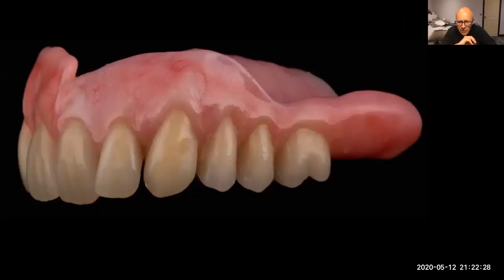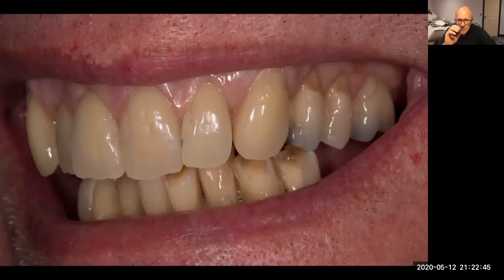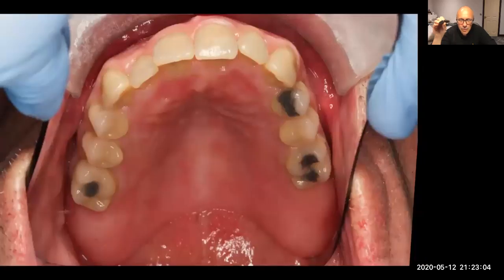But I want to share with you how to do that tooth characterization even more. So this is a case here. This is Ron's denture before it's been characterized, before the teeth have been touched. Then this is the denture in place after it's been characterized. We have some fun and we cut holes in the denture and put fillings in. So there's an amalgam there. There's recurrent caries here. He's got toothbrush abrasion and a filling just here. Look on the inside too. He's even got rugae on the denture itself. We do put that in quite a lot. And amalgams there.